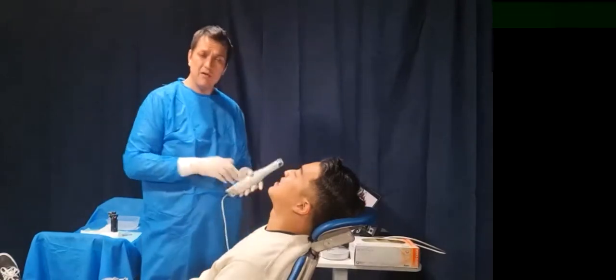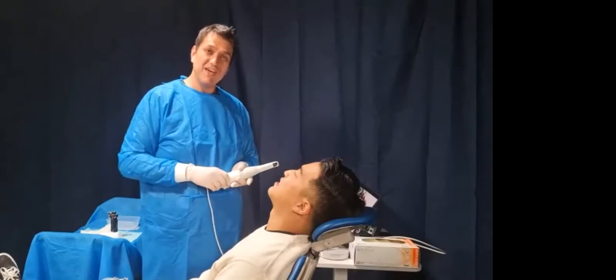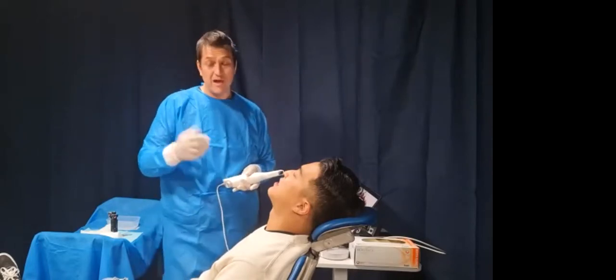We've got a bite now. Our patient is ready to have their splint made, and take it from me, 300 times we've done this technique in a row in our research period, and it works every single time. And you can also use this, as I said, for opening up full mouth oral rehab as well.